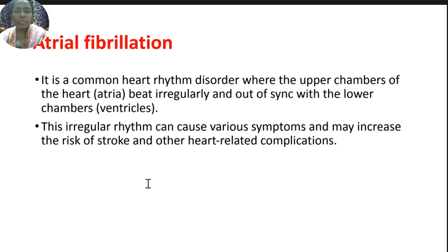Okay, what is meant by ischemia? It means a sufficient amount of oxygen is not supplied to the heart muscles. That is called myocardial ischemia. This shows ST depression, so the ST segment decreases.